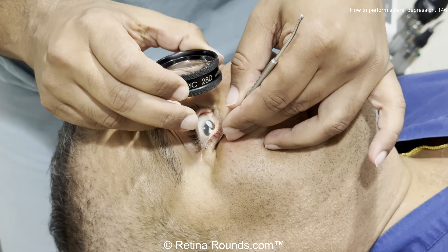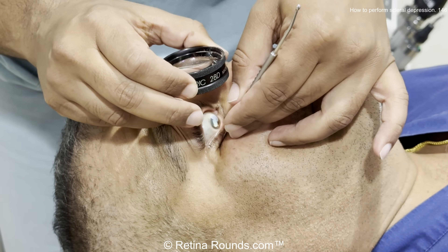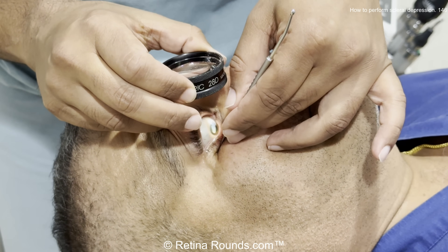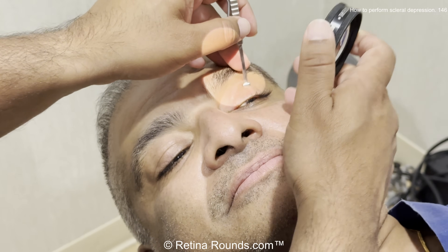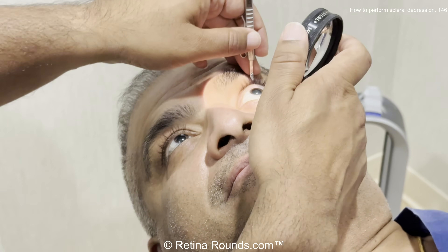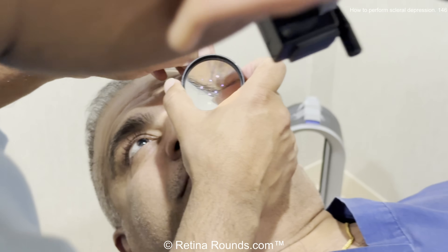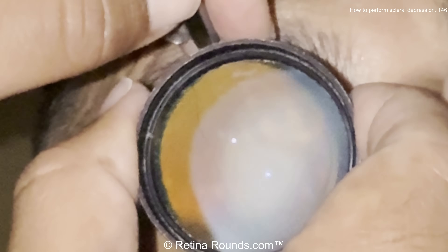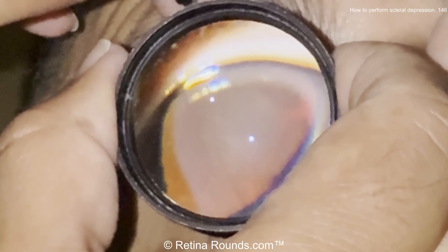Then I can move that depressor in an anterior-posterior fashion to get a dynamic view of the peripheral retina. Here's another example — I want to look at 12 o'clock, so at first I have the patient look down. Then as the patient looks up, you can see that the depressor rolls back in the eyelid crease and rolls posteriorly so that I can have a good visualization of the anterior retina and the vitreous base.